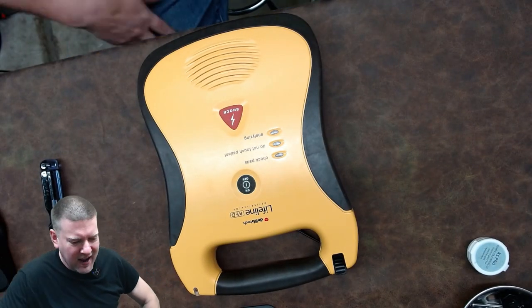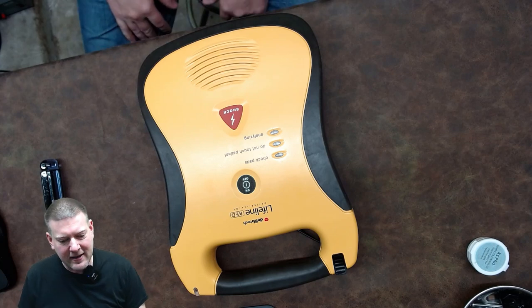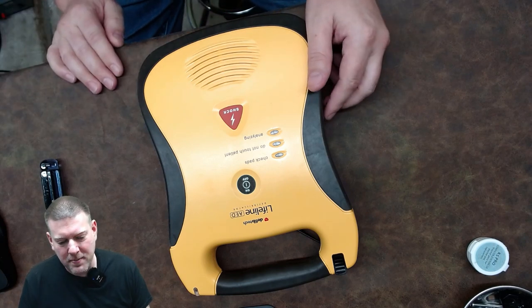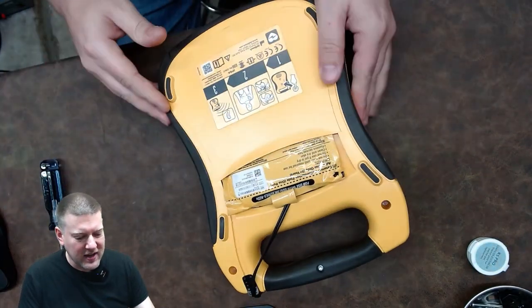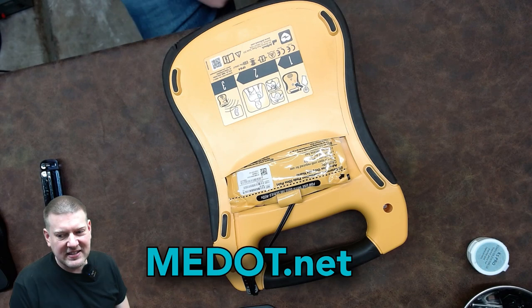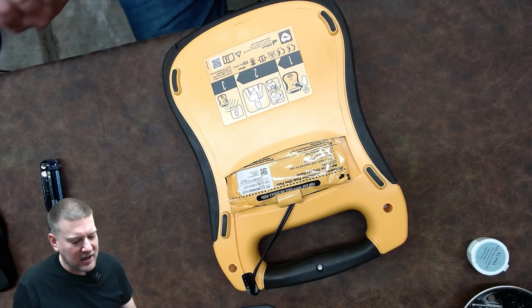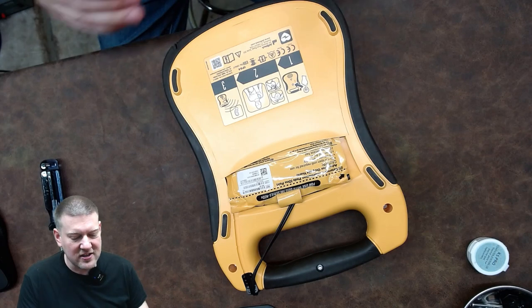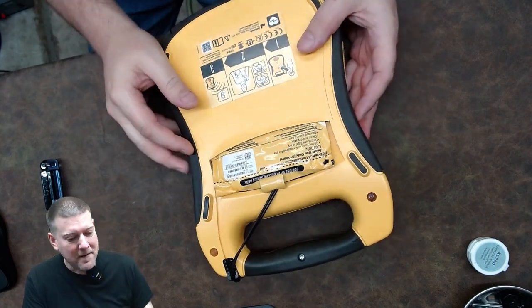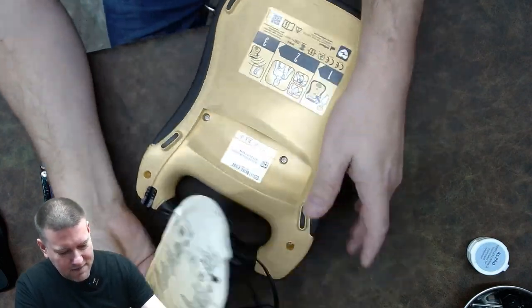Welcome back to Better Biomed. Today we're going to take a look inside the DefibTech Lifeline AED. I've always been curious how it works. This unit was provided to me by the guys over at Med.net. They do equipment installs and de-installs, and they're also a retailer of AEDs like this one. So thanks and shout out to those guys.